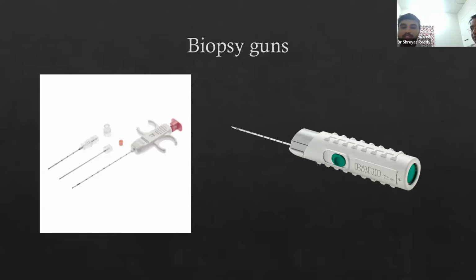We usually should never put the biopsy needle with the tip facing upwards. No. There is something called a tincture seal technique, where you seal the skin with a cotton swab and put tincture on that, and you seal the skin entrance so that the path created by the lung biopsy is sealed up, so that there is no entry of air inside. Entry of air through the chest wall entry site is very rare, but especially if the patient has pneumothorax, we can actually go and seal that.